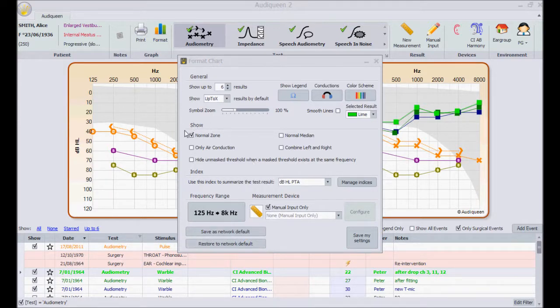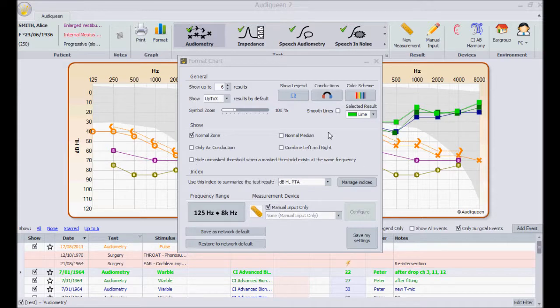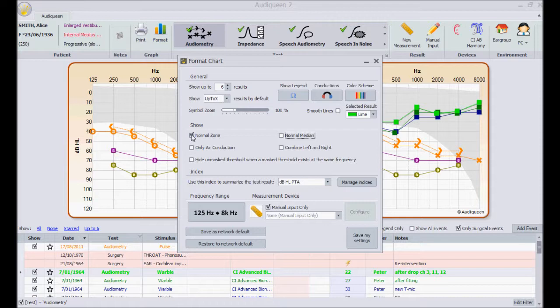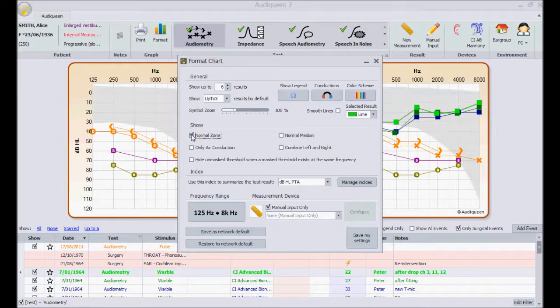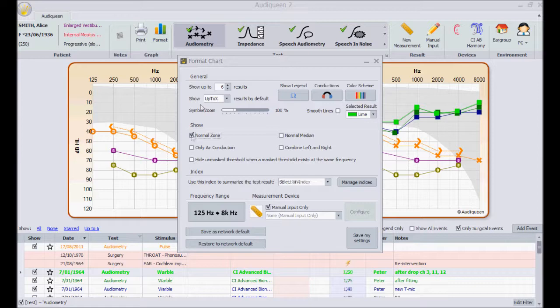Now a few test specific options. For audiometry, these options are self-evident. Feel free to play with these check boxes and see the immediate effect on the graph.